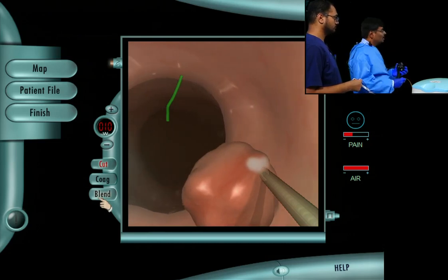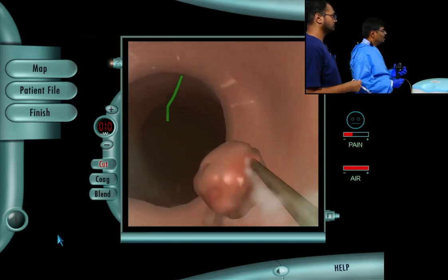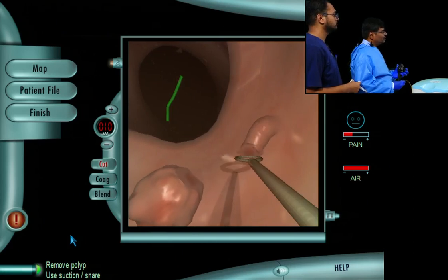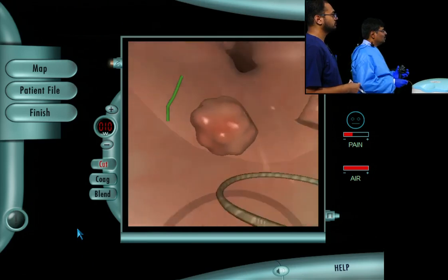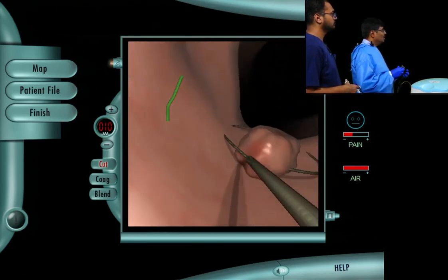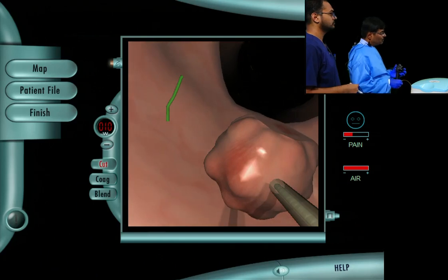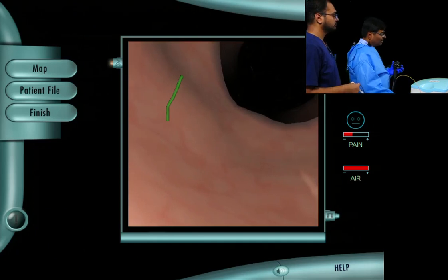Then just apply the diathermy. Close it further. Yes. See, like that it can. Then you have a retrieval device, then we can retrieve, or we can even with this same open. Close. Slowly, like that, you can go and catch it, and slowly you can take it out. So that's also possible. And for the timing, you imagine that you have already removed it. Then we are coming back.